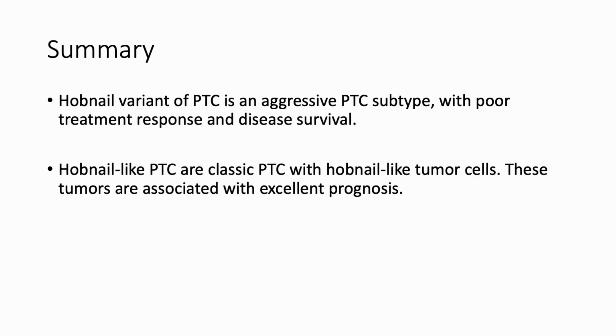To wrap up, hobnail variant of PTC is a rare, aggressive subtype characterized by complex papillary or micropapillary structures, pseudostratification, loss of polarity, cellular discohesion, marked cytologic atypia and increased mitotic activity, high proliferative index and frequent mutations, BRAF, TERT, and p53.